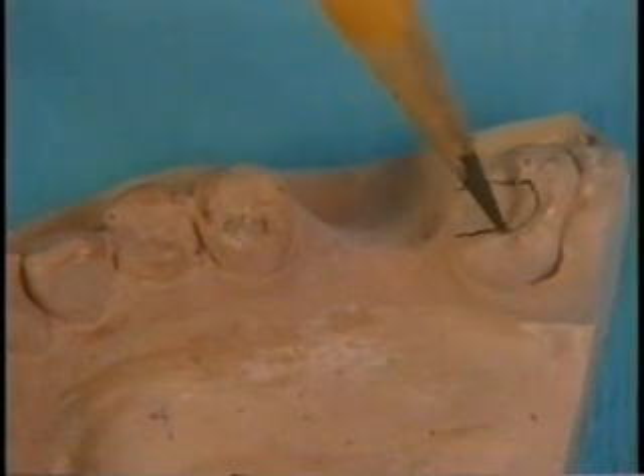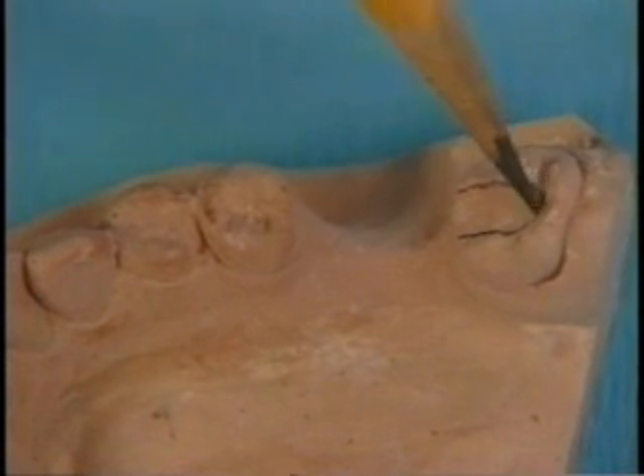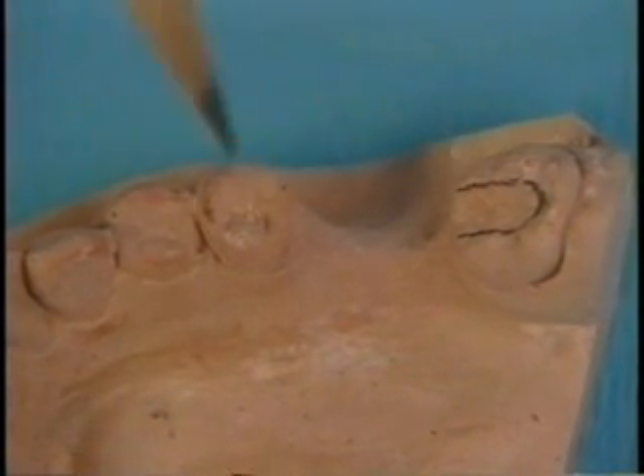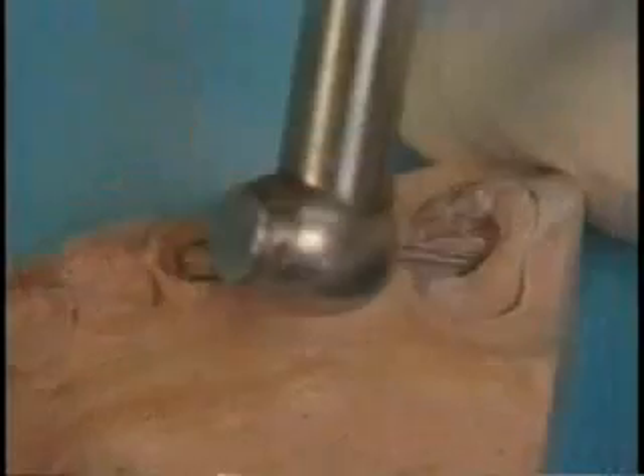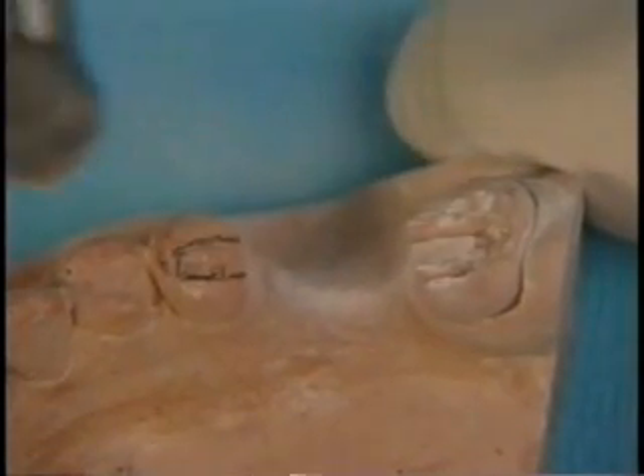After mounting and articulating the models, mark the location of the glassband attachments with a pencil. The abutment teeth are prepared on the model to accept a continuous piece of glassband rope. This is usually a horseshoe-shaped channel.